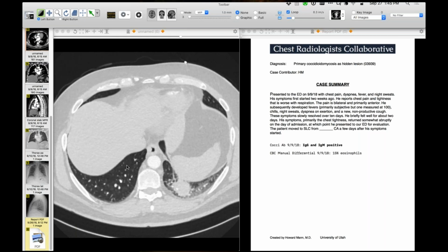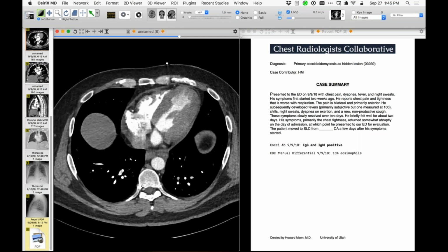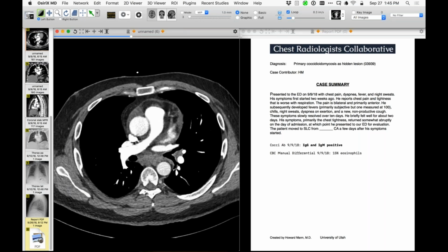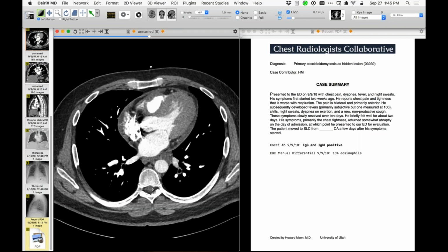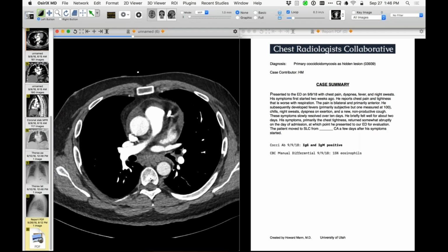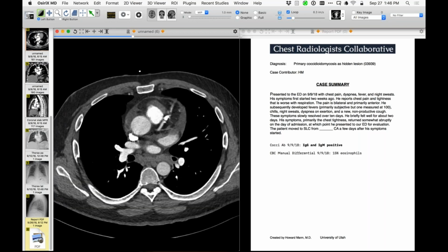Howard, what's going on with his pericardium? Does he? Oh, looks like he has a small effusion. He does have. Was it involved too? Because looking here shows that he had more anterior chest. I don't know. So there is some pericardial fluid, and there is some lymph node enlargement that's relatively modest. So I don't know. Yeah, that's actually an interesting speculation. Does he actually have a pericarditis as well? I don't know the answer. Well, this is why PE studies are terrible for looking at the pleura and or the pericardium, because you just don't give it time to enhance.